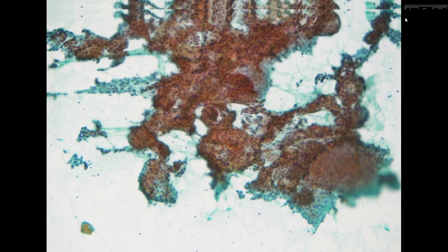So thyroid. This is a direct smear because in the liquid-based cytology, it is very scant. In this specimen, in the background, there seems to be no colloid, but we have this large chunk of material, and it looks like the cellular component was kept by some of these stromal components.